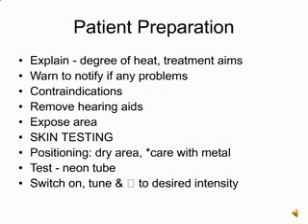Preparation of the patient should include a clear explanation so that informed consent may be gained. They may feel a very gentle heating, but they should warn you of any problems. The contraindications are outlined in the next slides. Hearing aids should be removed as the electromagnetic energy may interfere with electronic equipment.